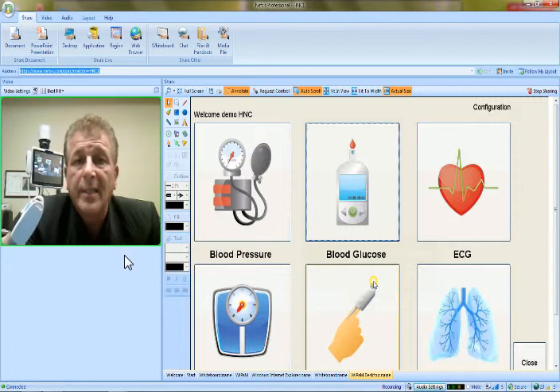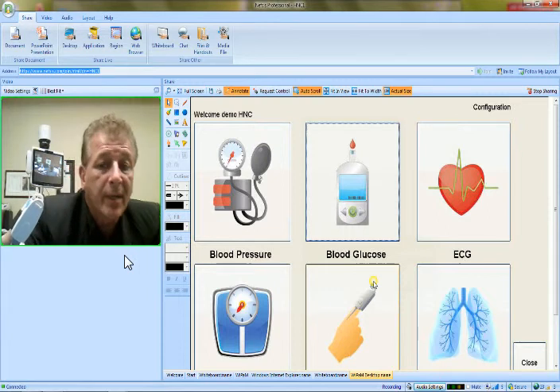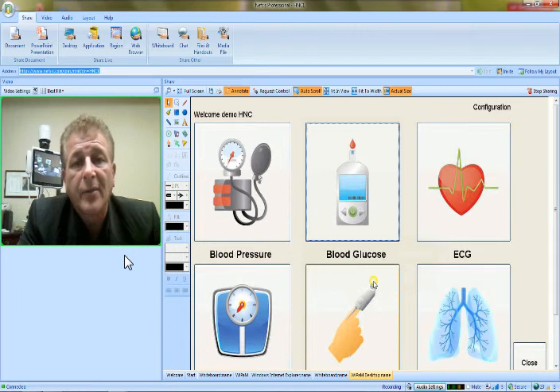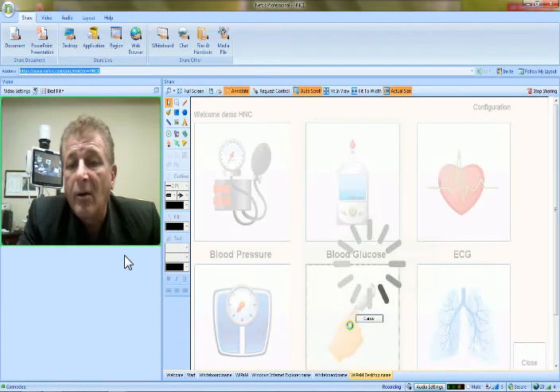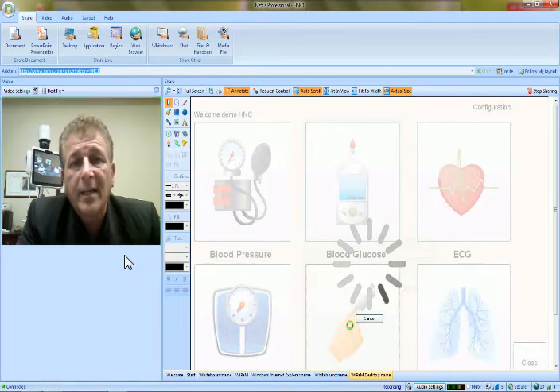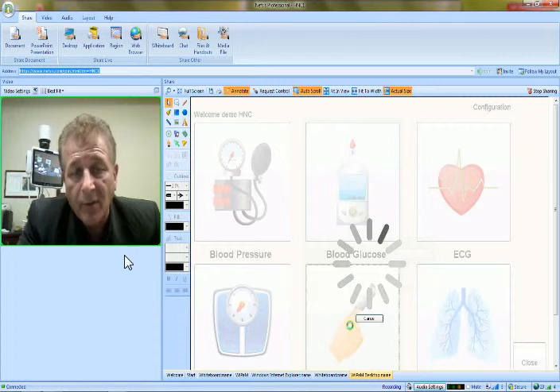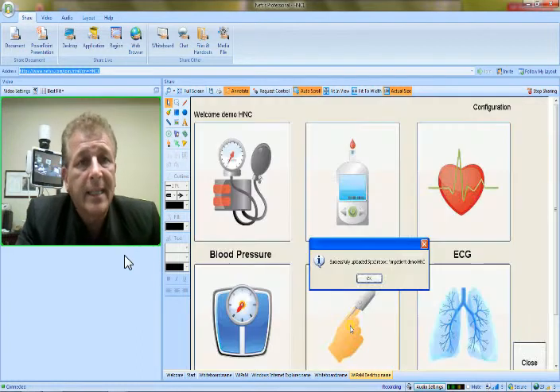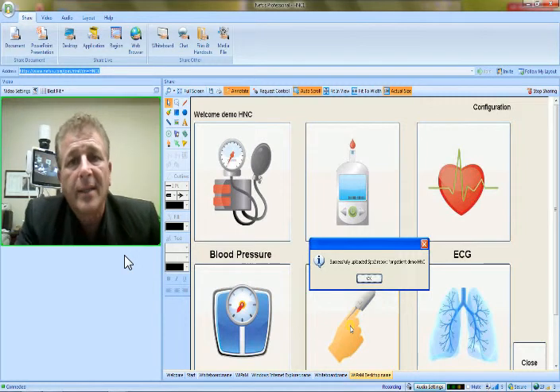And again, we tell the patient, once that reading is displayed, they'll touch the screen, this time where you see the little pulse oximetry button on the screen. So now our patient is touching the screen, and within maybe 5 seconds or so the results will send, and it'll say that the results sent successfully. Again, perhaps my cardiologist is in the Middle East and I'm in New York. They can look at this immediately and assess my results.